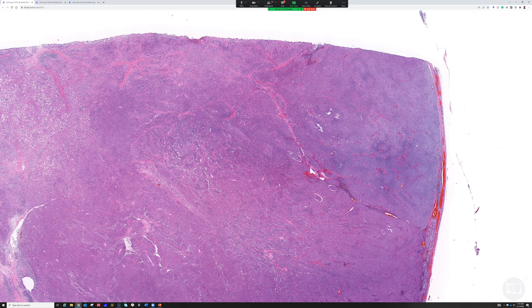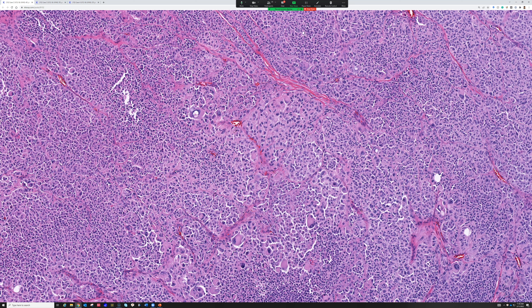This case looks way too pleomorphic to fit for clear cell sarcoma — they're usually not so pleomorphic. I usually start with SOX10, and if it's positive, I add MART1 to help confirm it. But I see melanomas with total loss of MART1 and HMB45 on a regular basis, particularly spindle cell melanomas and essentially always desmoplastic melanomas.